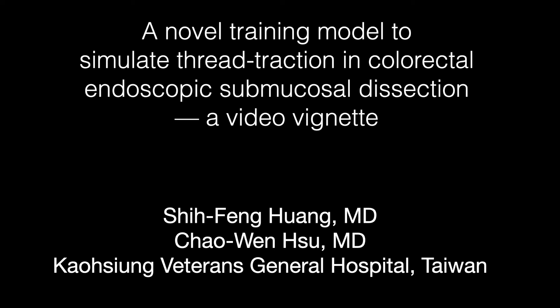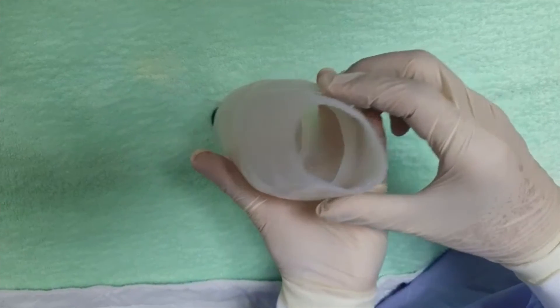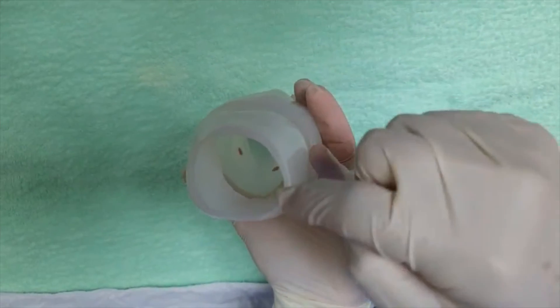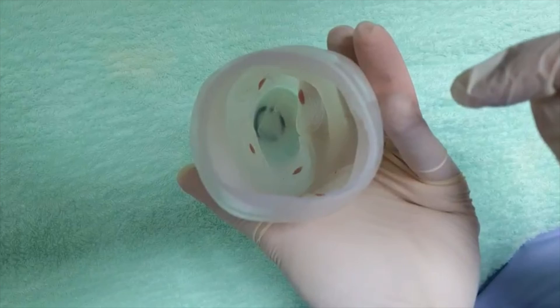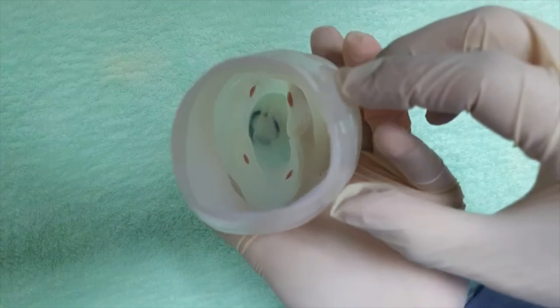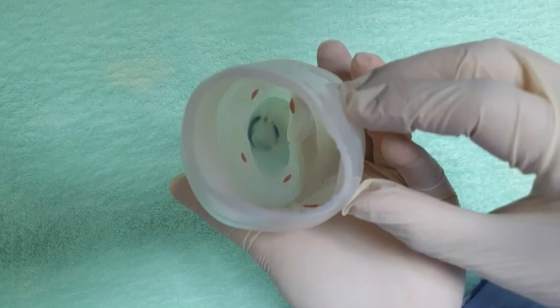A novel training model to simulate thread traction in colorectal ESD. This is the commercial plastic training model used in this study. There are five flat circular targets, 4 cm in diameter, installed on the inner side of the model wall.